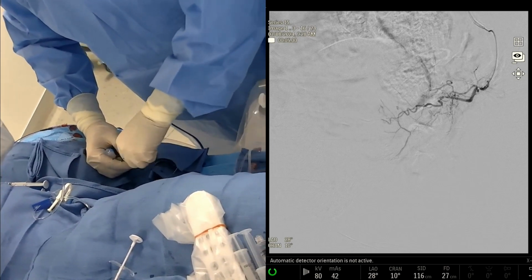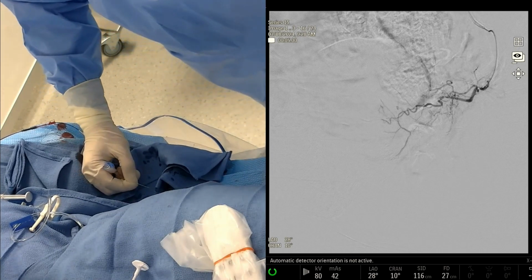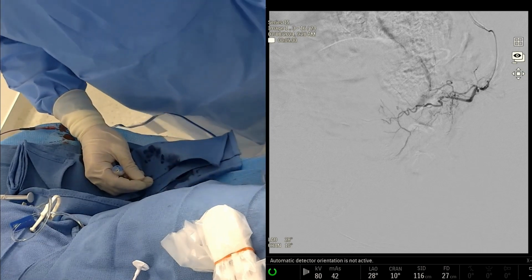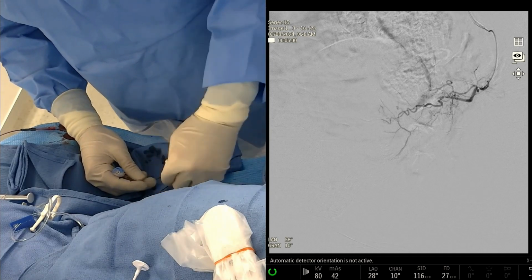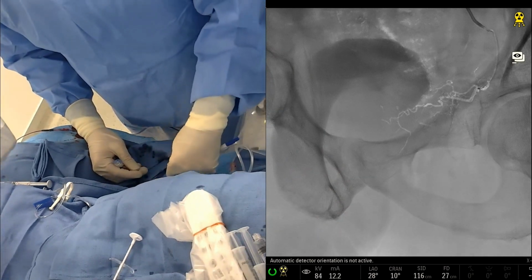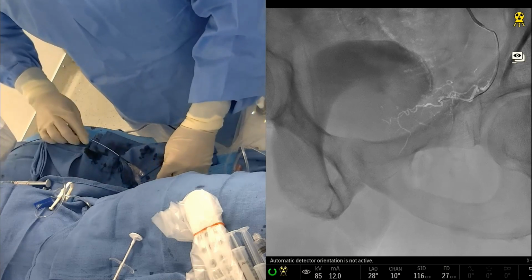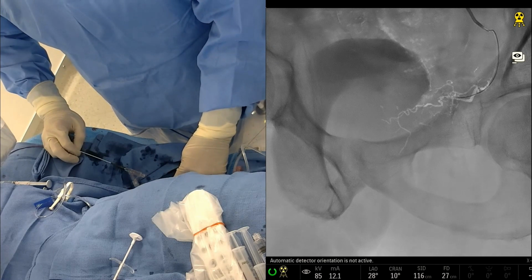And so we often get distracted by the main prostate artery. We forget about collaterals. There's often multiple pedicles that feed the blood supply to the prostate, in particular the pudendal below and the superior vesicular above. So in those scenarios, the cone beam CT with embolization guidance can actually show you all the feeders at once. But there are angiographic signs that allow you to do that without potentially needing to do that. And then the last reason we do cone beam CT is to look at the coverage of the gland after embolization, which we may actually do today to show what that looks like for everybody as a demonstration.